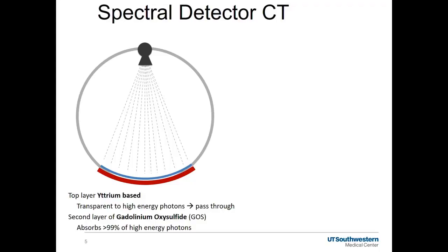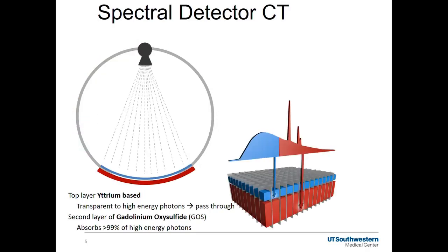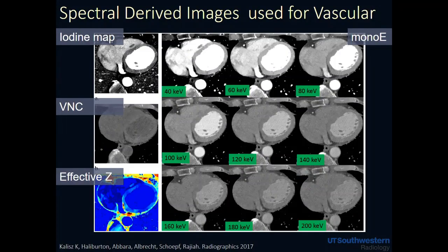So this is how they work, like a third generation gantry CT, where you spin around the patient like usual, and in this case with the spectral detector, you have this sandwich of one detector seeing the lower energy and then the larger second detector seeing the higher energy photons. And in reality, those are the spectra that they read, so the area below the curve is where they overlap, so that information doesn't differentiate, but the sum of the areas between those curves are differentiating information that you get from these two detectors. So detector-based spectral CT is what we're talking about.